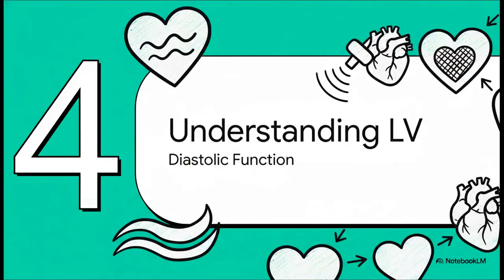We've spent so much time talking about systole, the squeeze. It's time to pivot and talk about the other, equally important half of the story, diastole. That's the relaxation and filling phase.